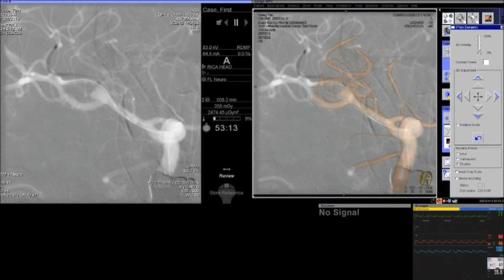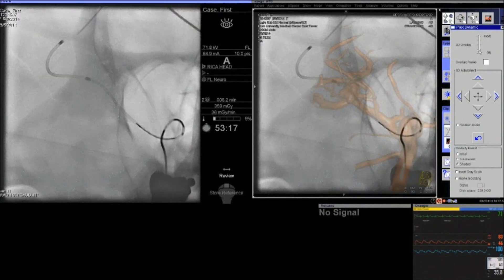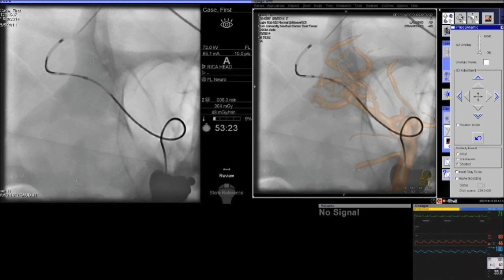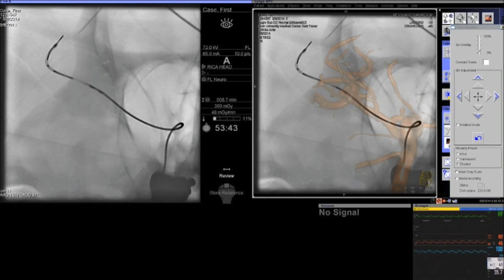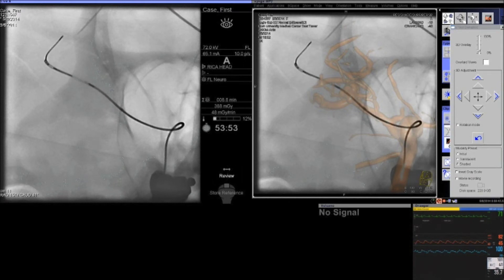In this case, we chose the shortest Enterprise stent available. One could use an Enterprise without the distal tip; in this case we have one with a distal tip. The more distal you go into the anatomy, the more beneficial it is to use delivery systems that have no distal wire.